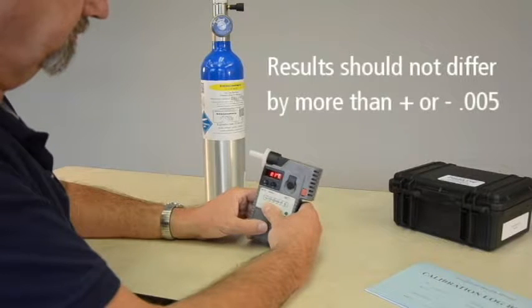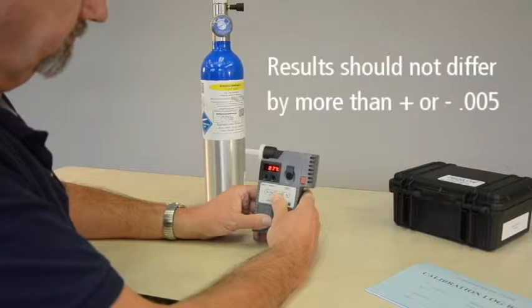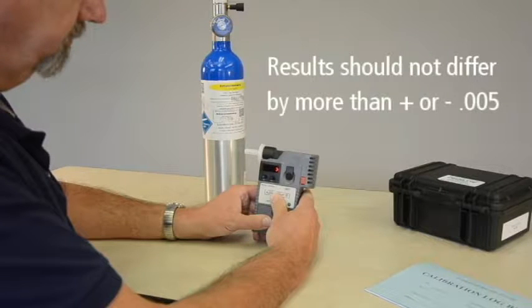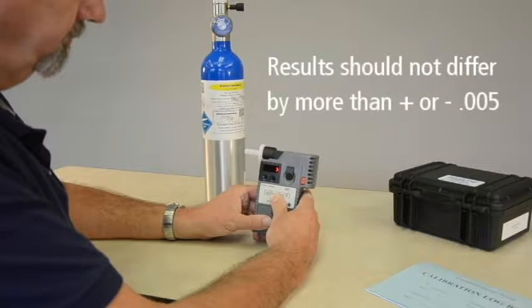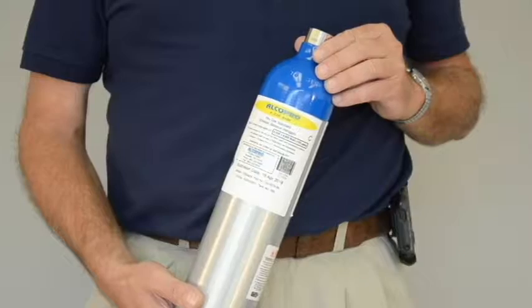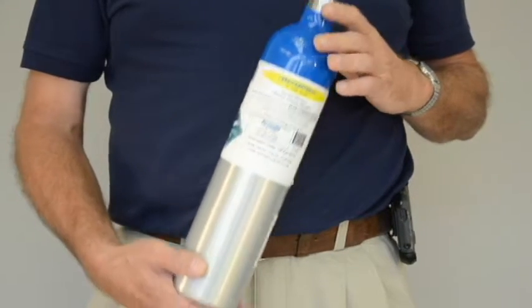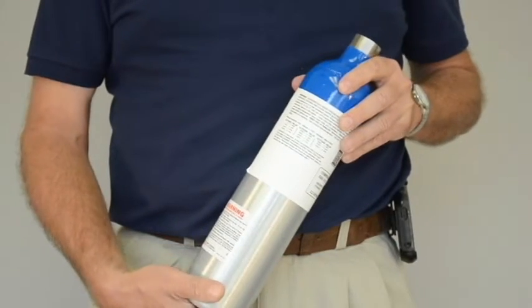The result of your accuracy checks should not differ by more than plus or minus .005 from the expected value of the standard gas sample. The expected or target value of your gas standard can be derived by referencing the altitude chart on the back of your tank.